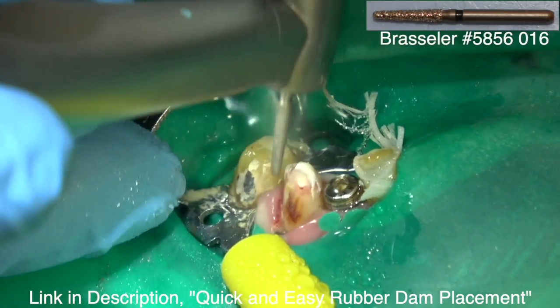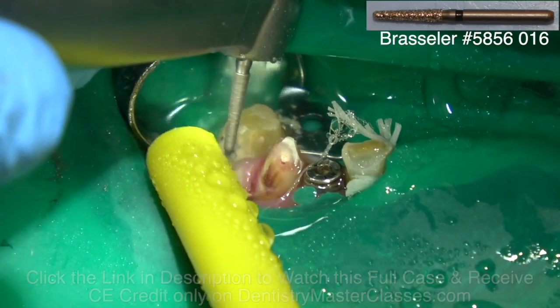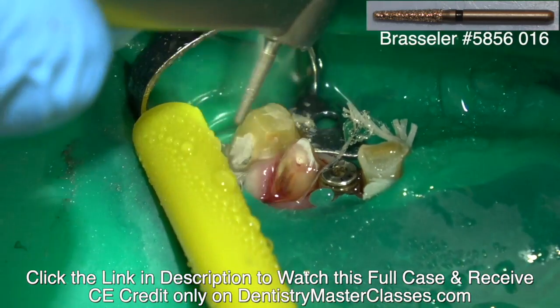I'm reprepping this tooth. You can see the decay that's into that and the red right here. This was a hyperemic tooth, so we're going to perform endo on that cuspid.